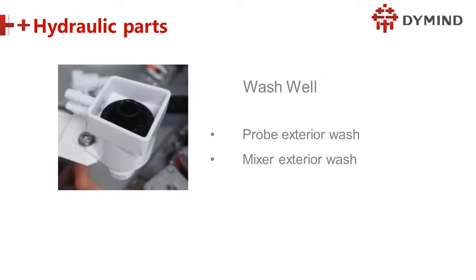And this is the wash well. What is it for? For probe external wash and mixer external wash. For internal, it cannot wash here. Remember, internal is washed in another place.